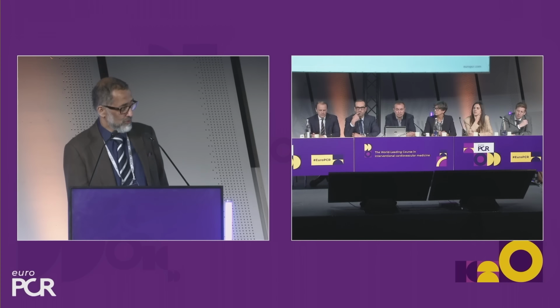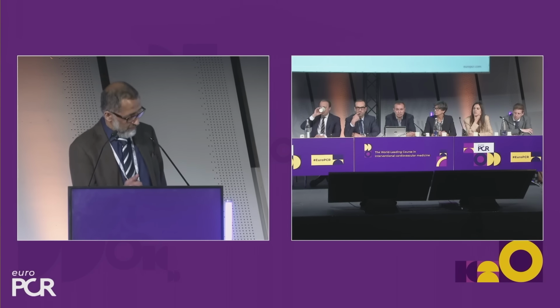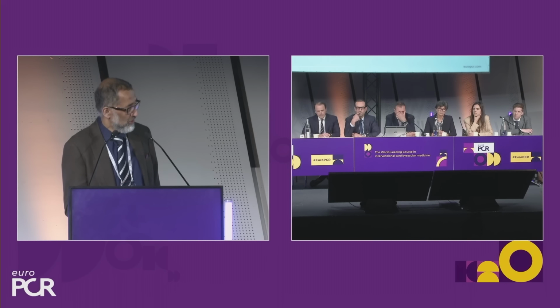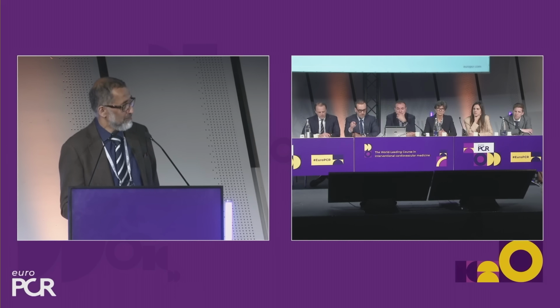And our day case protocol, the criteria is a straightforward femoral TAVI. They've either got a pacemaker or a normal ECG when we start. And more importantly, they've got social support at home. If they've got those 3 things, we want to do a day case TAVI if at all possible.